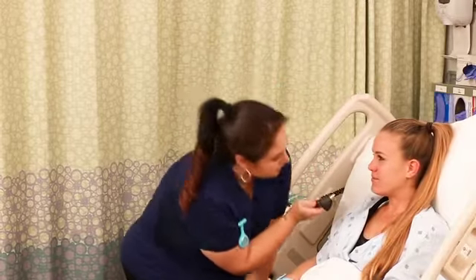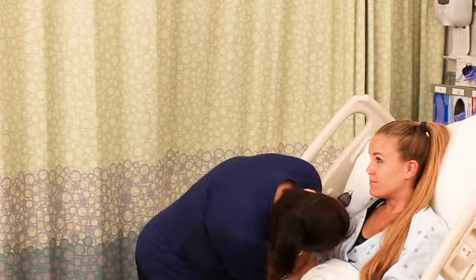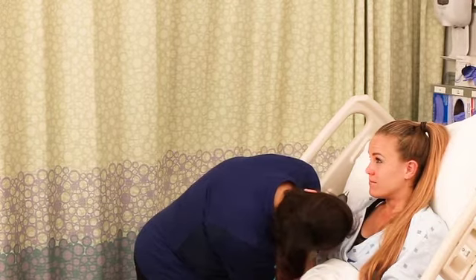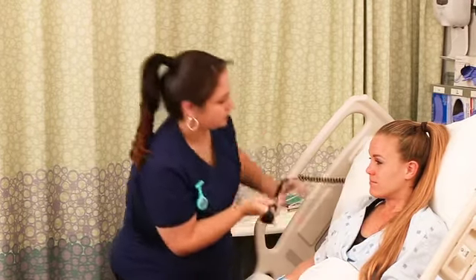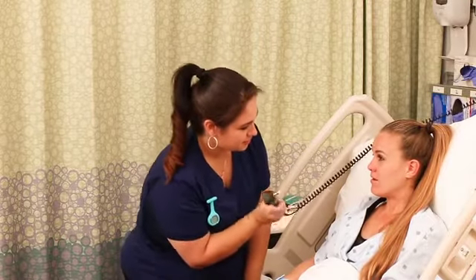Now, here's why we did that part last. We're actually going to hang onto the otoscope and move right into inspecting the inside of the nose. This is all about efficiency, guys. You want to look for discharge, hair distribution, and polyps. You also should look to see that the septum is midline and that the turbinates are beefy red.